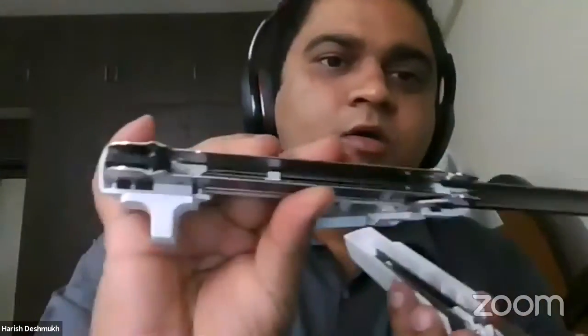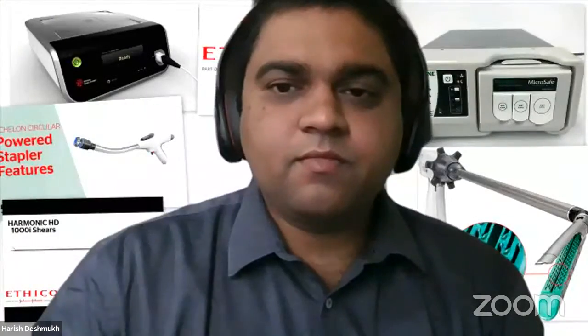One thing which I missed out earlier was that after every firing, the anvil and the gun, both should be cleaned of the used stapler pins or the fired pins which are not utilized in the patient. Whatever unused pins are lying in the gun, or any tissue or debris, should be cleaned off, so that the next firing is smoother and safer. Because sometimes the unused pins still lying in the gun can lead to issues with firing.